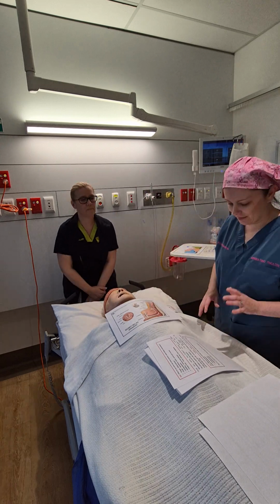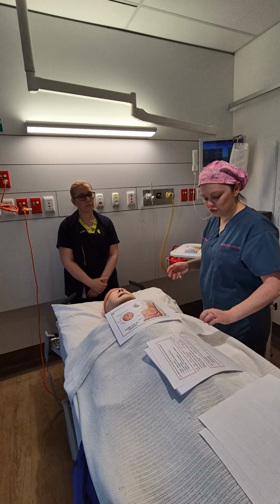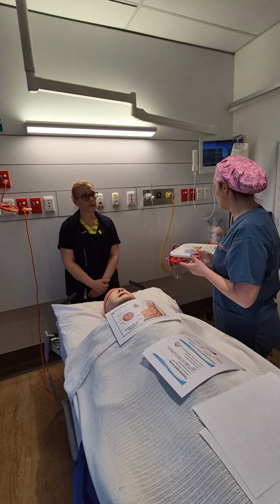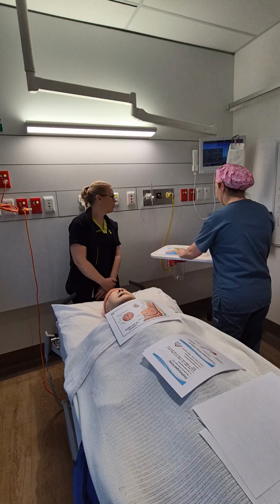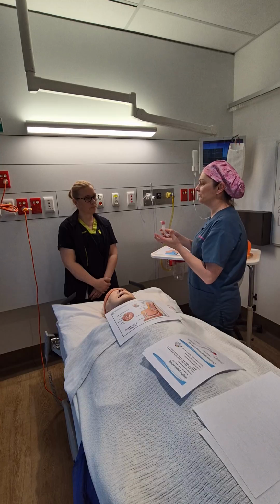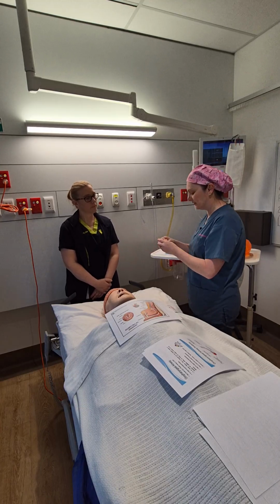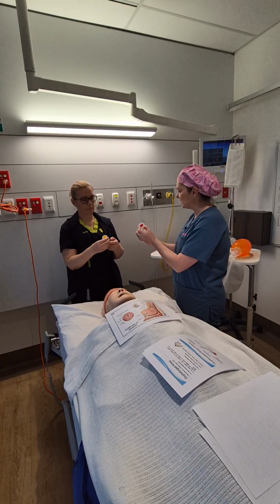Excellent. So we'll move on to airway adjuncts next. So the 2 most common ones that we use are the oropharyngeal and the nasopharyngeal. So we'll start with oropharyngeals first. I've got a big selection here. So this is the oropharyngeal, also called an OPA, or the old school name is a Goodell. We find a lot of the old school doctors will say, grab me a Goodell. I'll get you to hold one as well. You can feel that it's nice and hard.